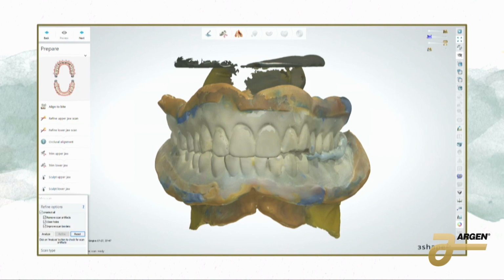There are more and more workflows that are introducing a reference denture with a wash impression. I don't believe that you can get a very good intraoral scan fully edentulous. If you think about it, if you open your mouth and you have no teeth in there, your retromolar pads are now stretched wide open. This tissue back here, right? So if we're now scanning that and your mouth is stretched wide open and we try to put a hard plastic item in there after the fact, that's not a functional impression. That's a static impression of your mouth wide open.